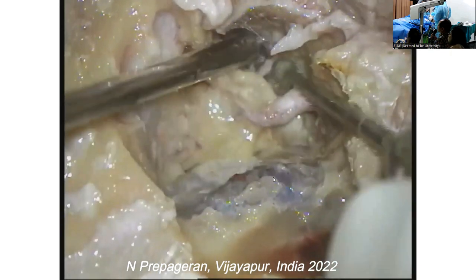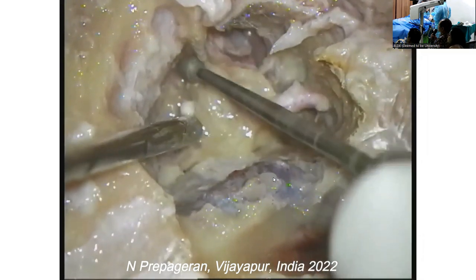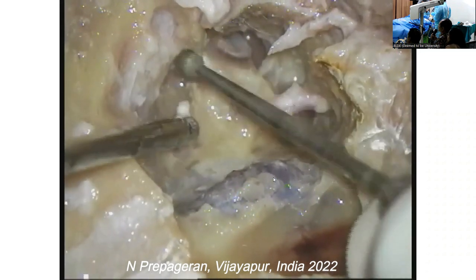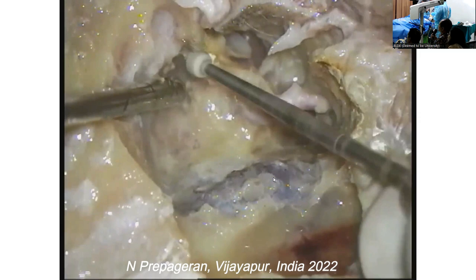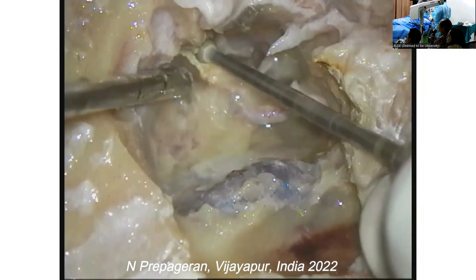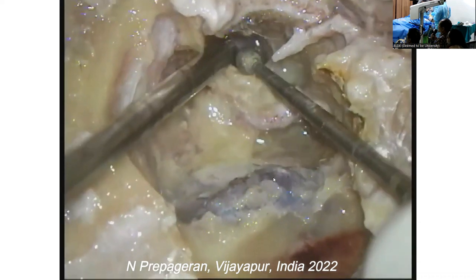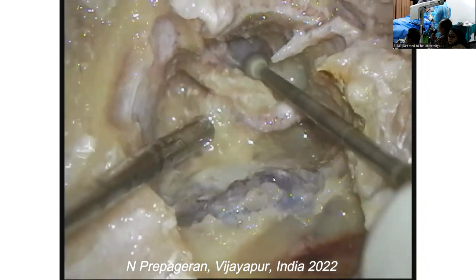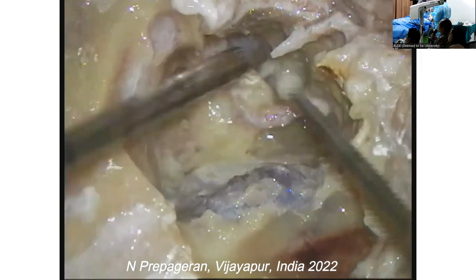Now what I would like to do is open this up and remove the ossicles. Then I will open up and show you our biggest enemy in skull base and how you identify him. That's the buttress he's smoothening. You have to remove the posterior canal wall with the superior portion of the bony external auditory canal. And then he's smoothening the posterior canal wall now.